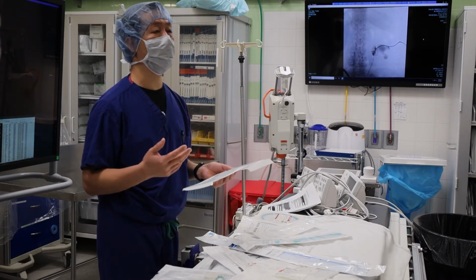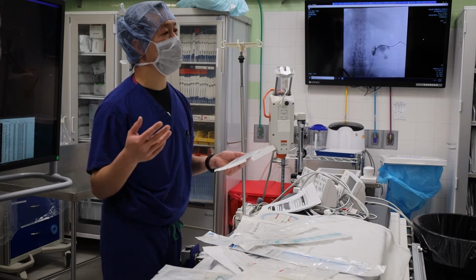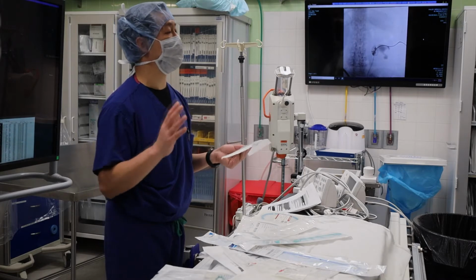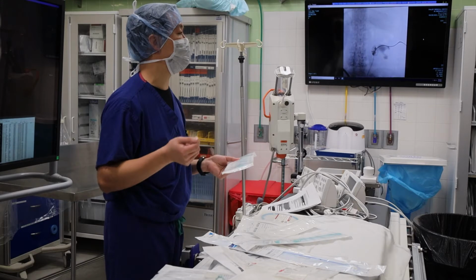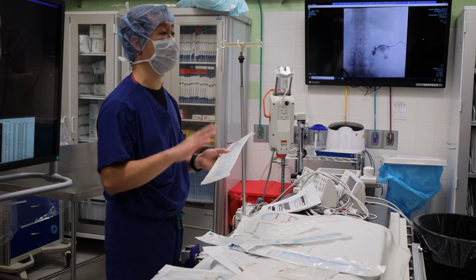Long-term patients, like one of our patients who comes in all the time and gets tube changes under anesthesia, doesn't like being sutured all the time, but she's had this tube for years, and that tract is mature, and there's less of a risk if it gets pulled out. At that point, the suture is more irritating than no suture. But fresh tubes, we should try to secure extra carefully.